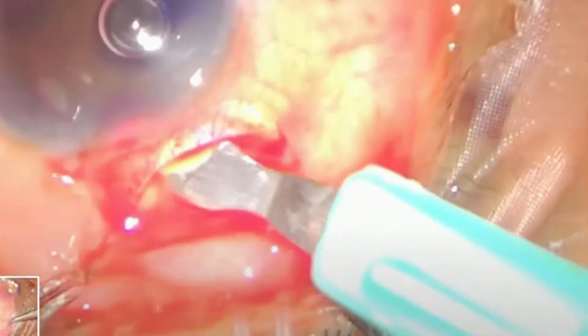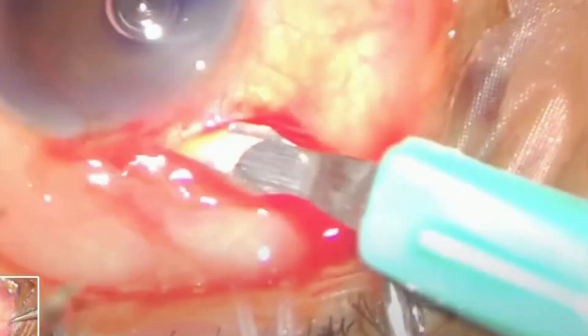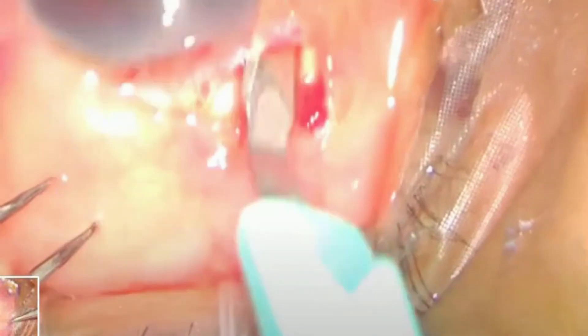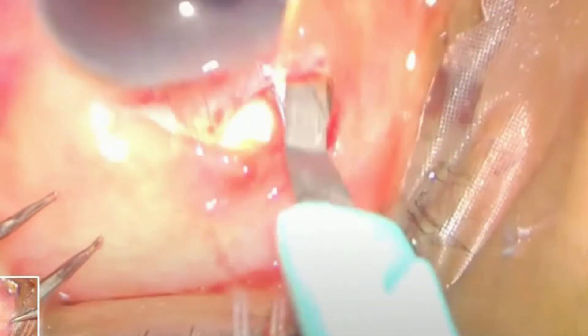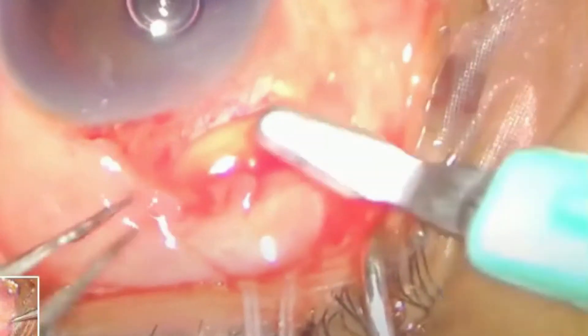If the crescent knife is not visible during the incision, this indicates that you are working too deeply inside the sclerocorneal tissue, and you may perforate towards the anterior chamber's angle — a premature entry. A premature entry could lead to surgical complications such as iris trauma, iridodialysis, iris prolapse, and a tunnel which is not self-sealing. Manage a premature entry by starting a more shallow dissection at the other end of the tunnel; suturing of the wound is required at the end of surgery. A crescent blade with bevel facing down may be useful in this situation.